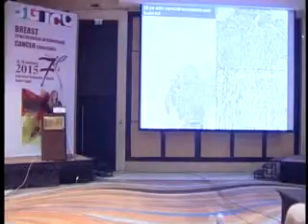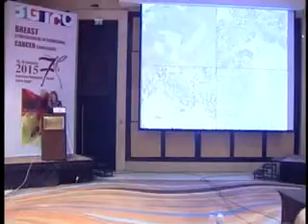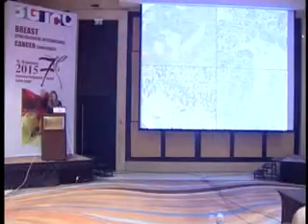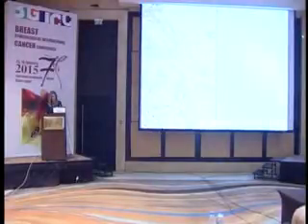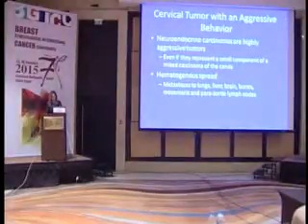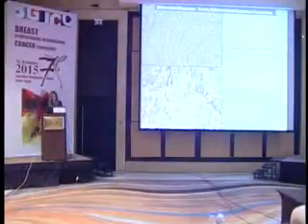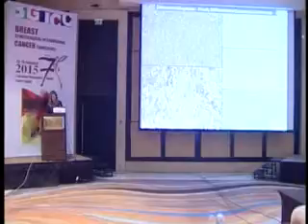Unfortunately, it goes to the brain. Okay? This is brain material, and it goes in. More geographic, this is more in the brain. P63 negative, because this is your differential diagnosis, chromogranin positive. So it is neuroendocrine carcinoma. It's a very highly aggressive tumor. And the differential diagnosis of squamous cell.